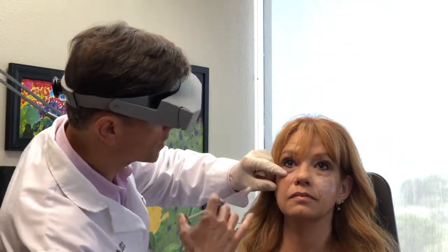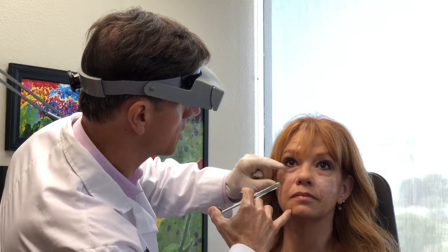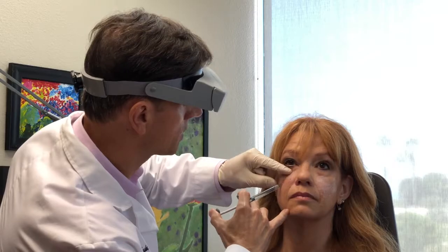We now have a more youthful appearance of the cheek, better contour, and blending of the malar area. Depending on aesthetics, we could come further out. What we see now is that the high point of the cheek and the lower face are in more of a smooth and uninterrupted curve. I still would like a small augmentation right in this area, which I will do with needle, aspirate, and inject — just to bring this area up a tiny bit more. And now I like the contour of that cheek.